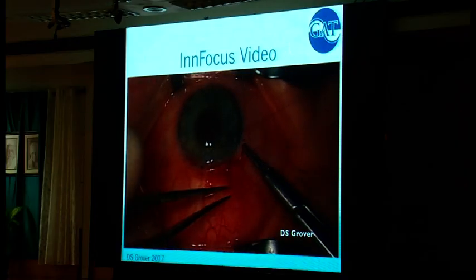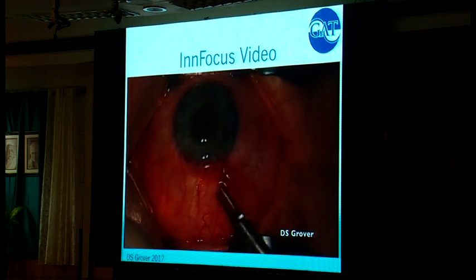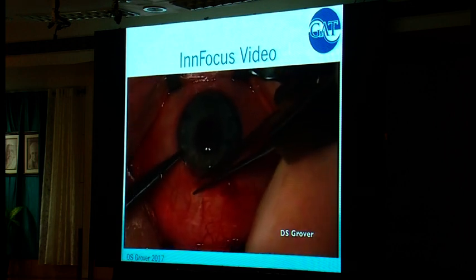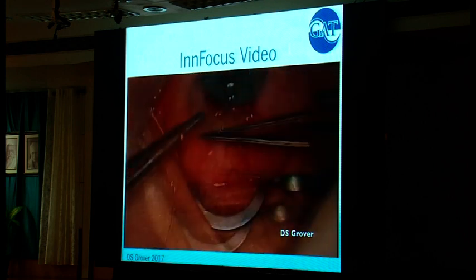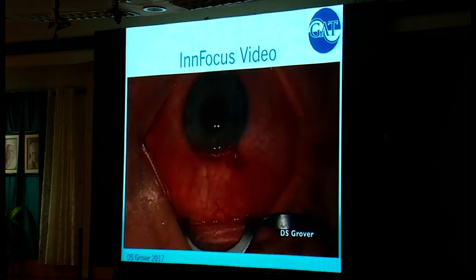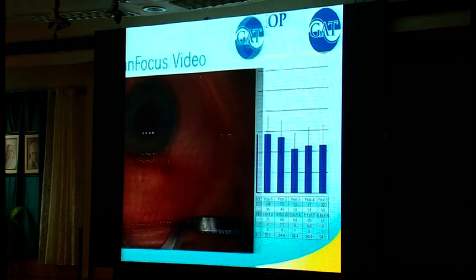How I like to close. Both of these implants, the inherent resistance within the implant because of the lumen prevents hypotony. And then, yeah, so that's the way. And then you're going to see as I tighten this, you're going to get that tight anterior tension. That's what I like to see on all my implants, be it tubes, be it trabs, or be it these implants. I like to see that tight thing.